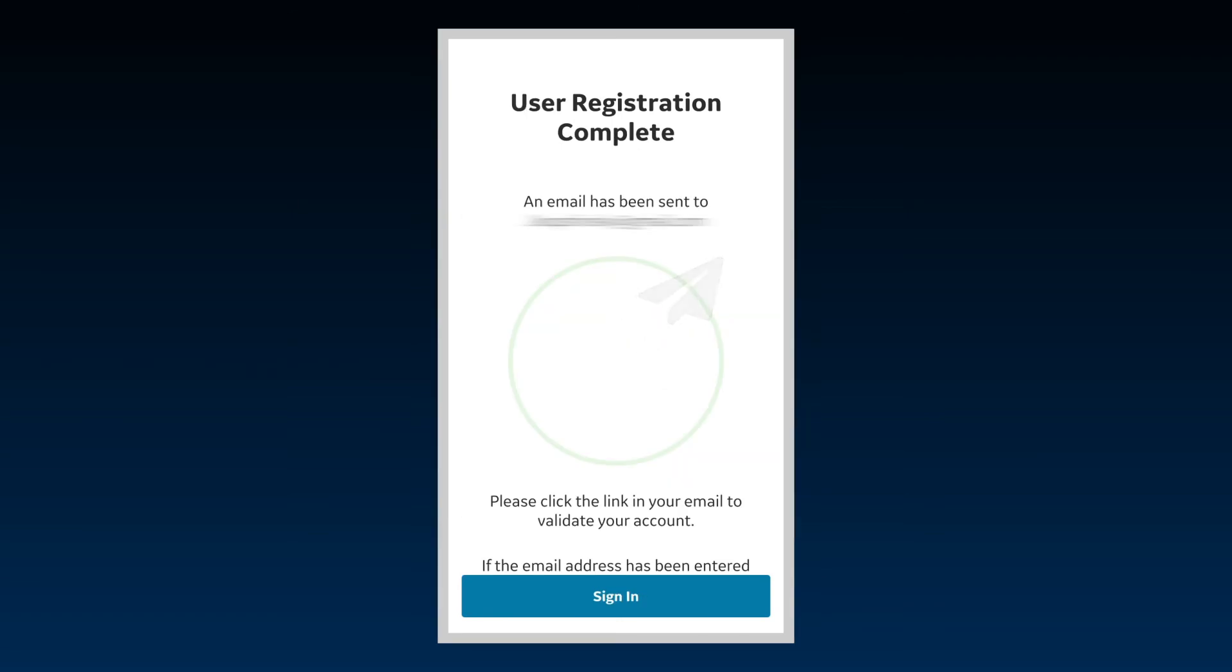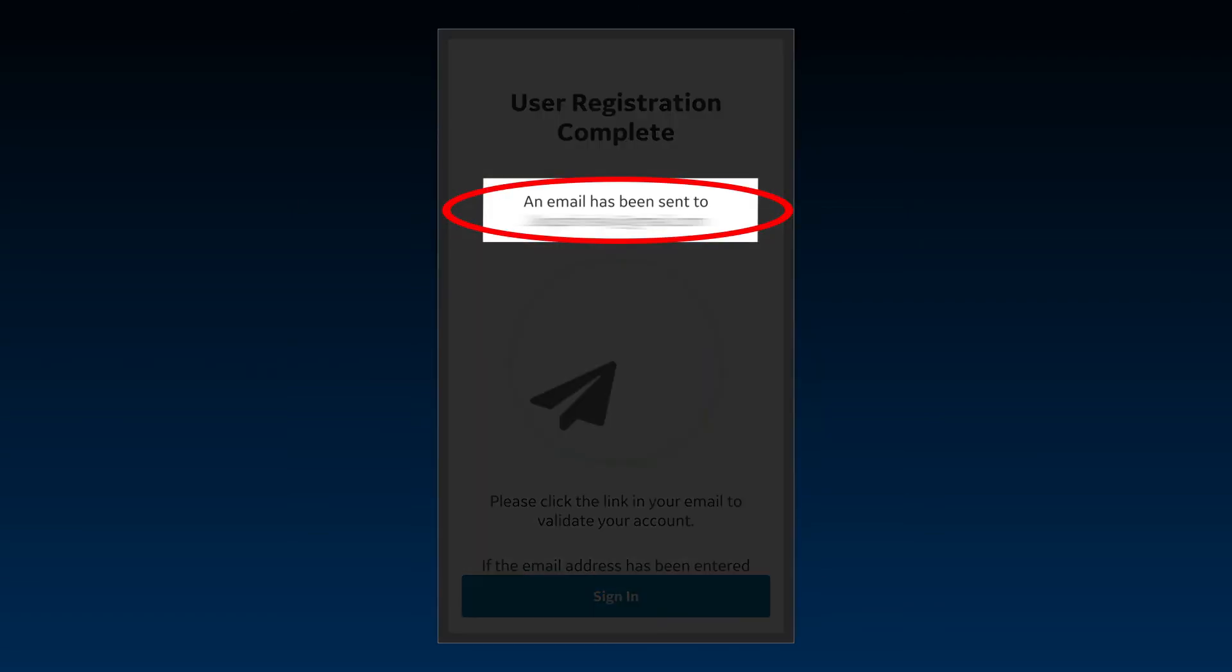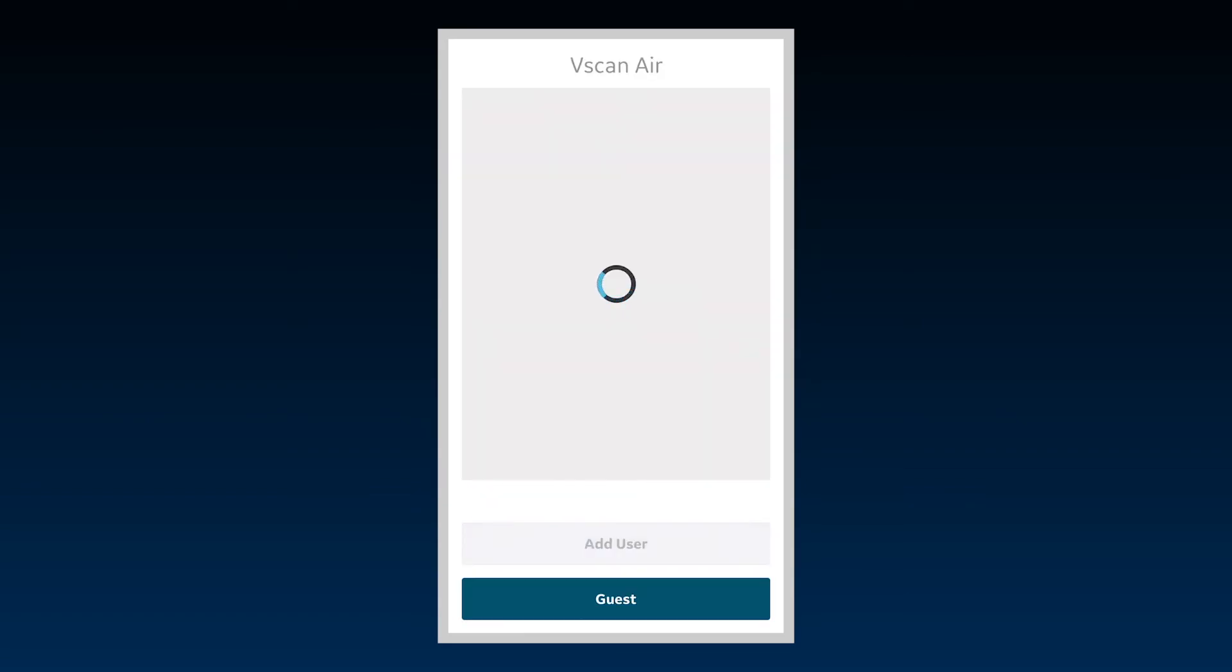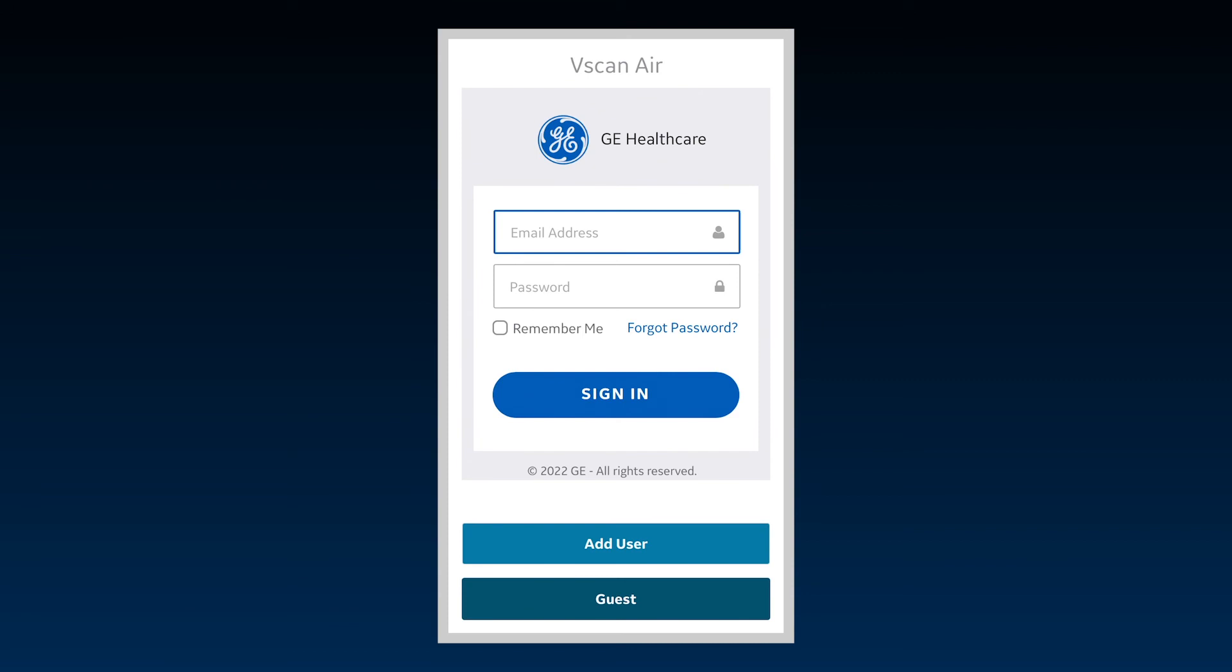An email will be sent to validate the email address. Once the email is validated, the user can sign in to use the app. An account only needs to be created once. Your credentials can be utilized to sign in to the vScan Air app on any mobile device.